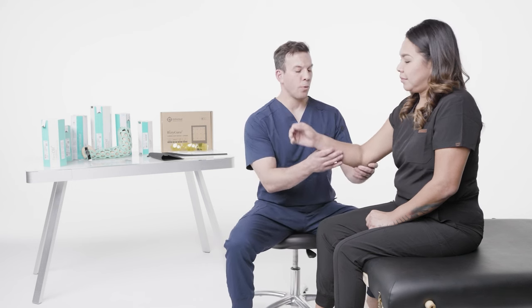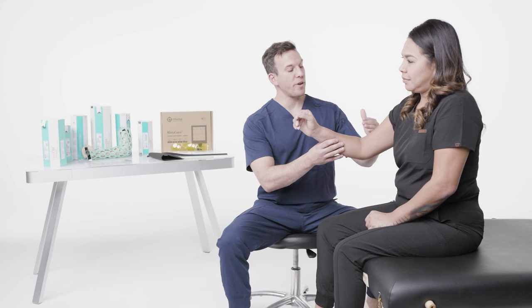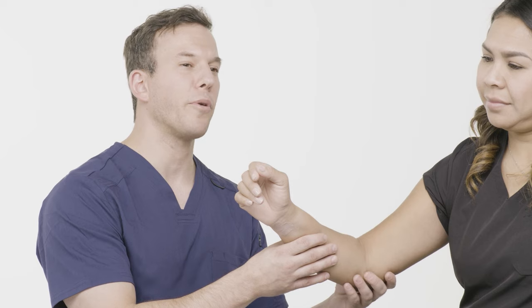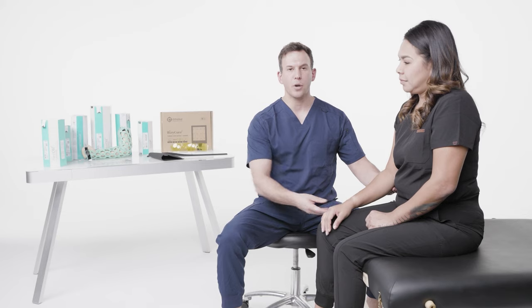I'm Dr. James Stabitz, and I'm here with OrthoHeal and the Flexio long arm immobilizer. We're going to go over the long arm immobilizer. This is going to be for any issues with the distal humerus, the proximal forearm, or any kind of elbow issues that a patient may have.